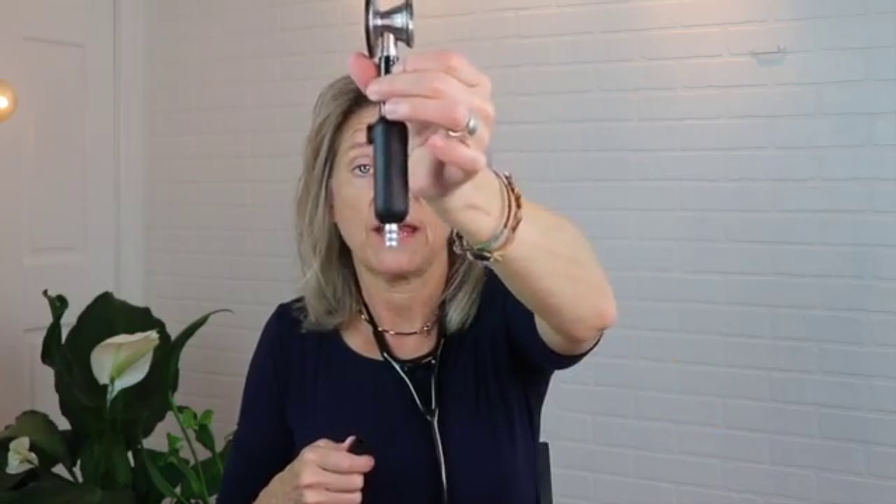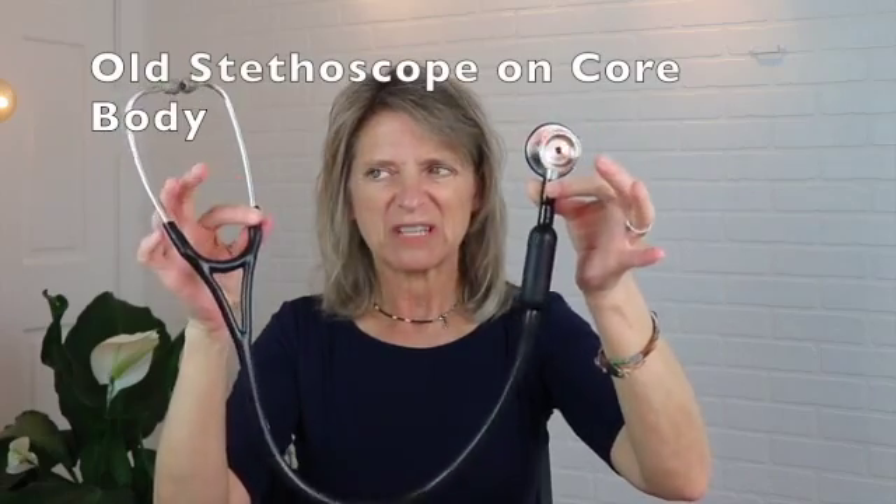To be fair, I'm going to try the Core body versus the Echo attachment to see if there is a difference. This is the original Core body of the Littman Core stethoscope with my old stethoscope on it — so it's not the attachment. This one says B2FB. I think I goofed. I wanted you to know that the body of the Littman Core stethoscope is the same as the Echo attachment body, so I can hear with both through the old Littman Cardiology 3 tubing.